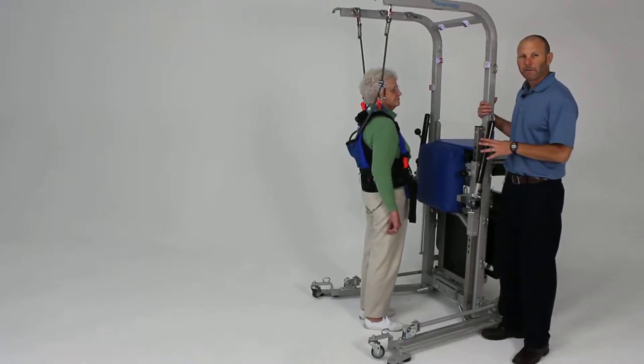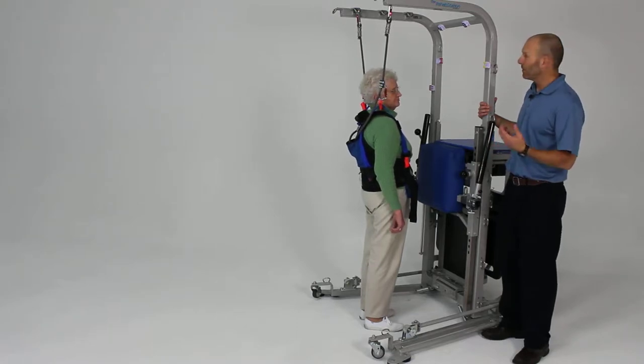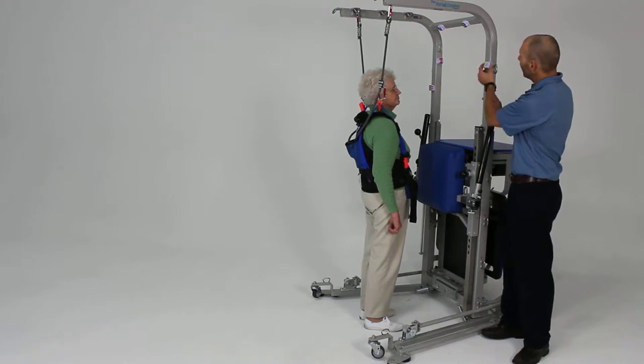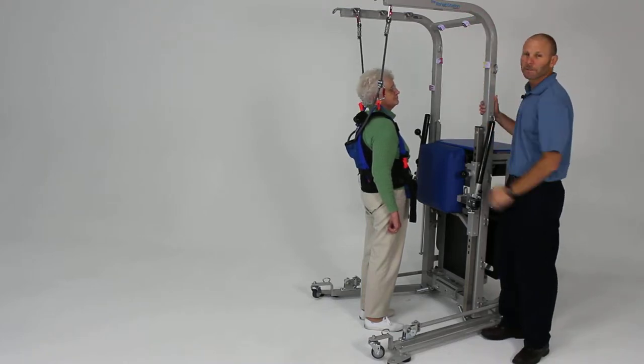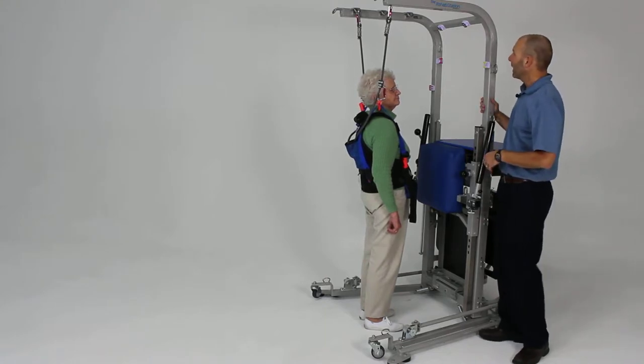The rehab station provides a great environment for doing lots of different activities. For the upper extremity, another thing you can utilize is that since it's made of metal, we can use magnets. We can place them in different positions on the unit to facilitate reaching activities.